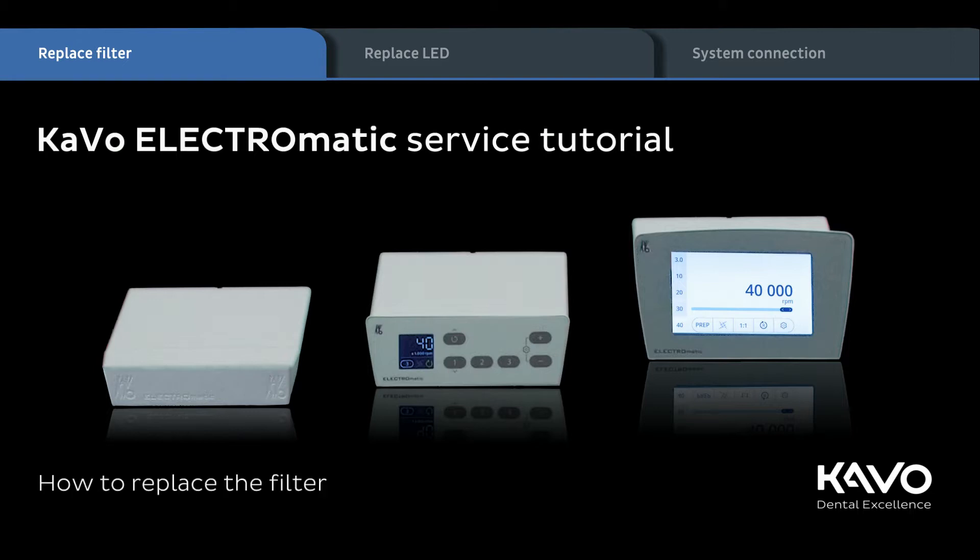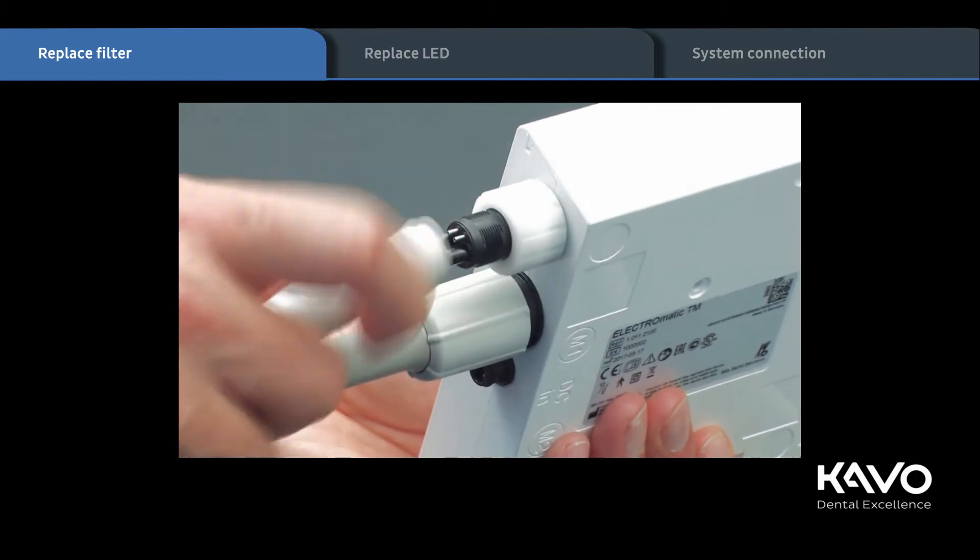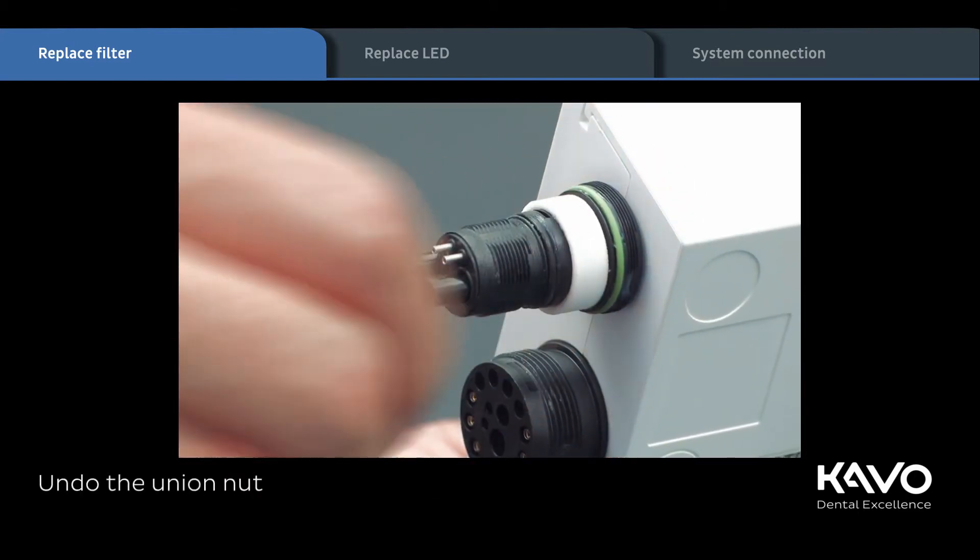We recommend checking the filter every 3 months initially and changing the filter insert according to need. As a first step, unscrew the 4-hole turbine tubing. Then undo the union nut.